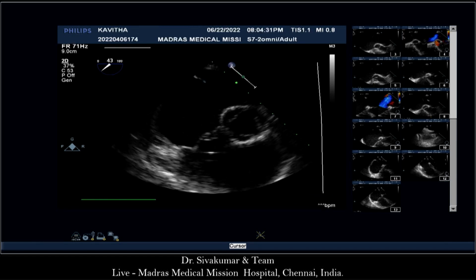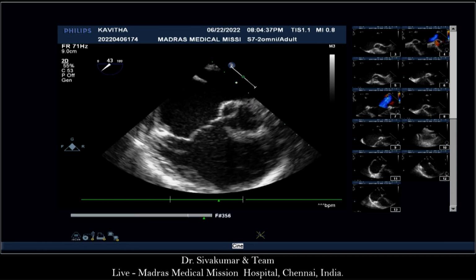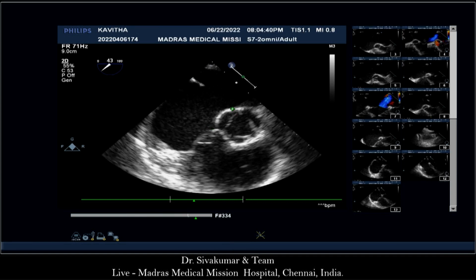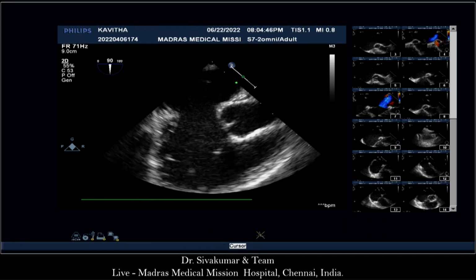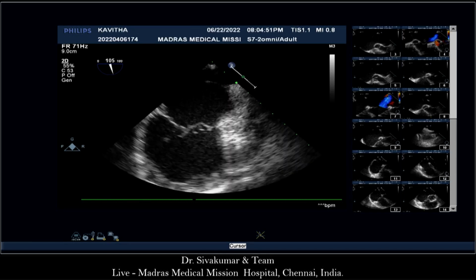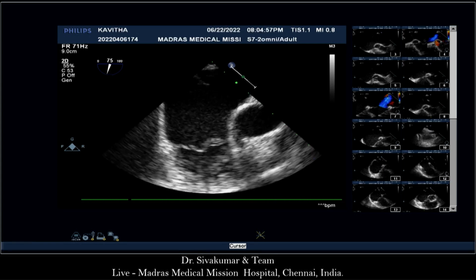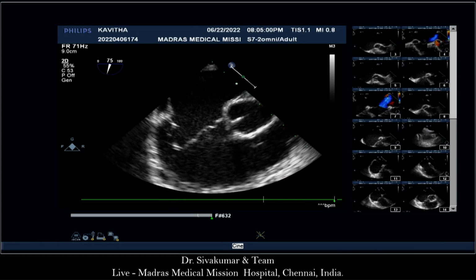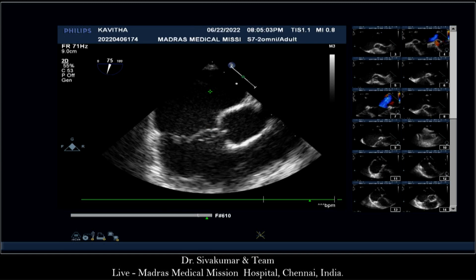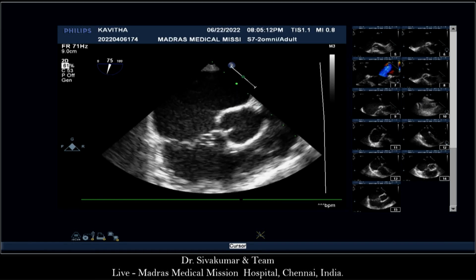So this is a 45-degree view, which is showing a deficient retroaortic margin and a good posterior margin, and it measures around 24 here. To the bicaval view, 90 degree. It's 25. So the maximum measurement was 31 in the apical 4-chamber view. And other rims look adequate.